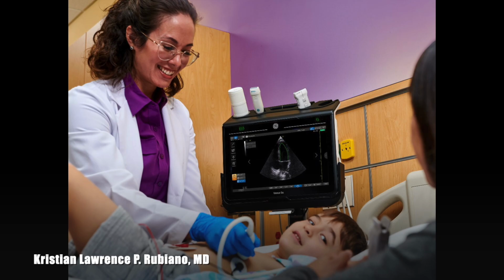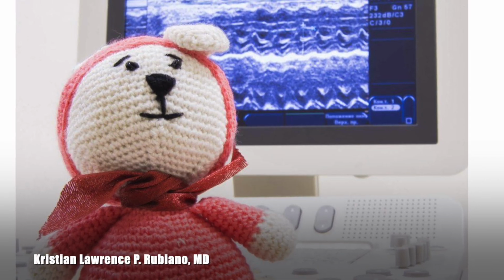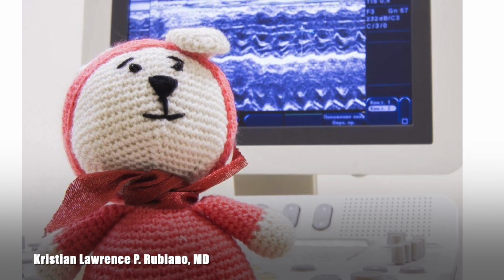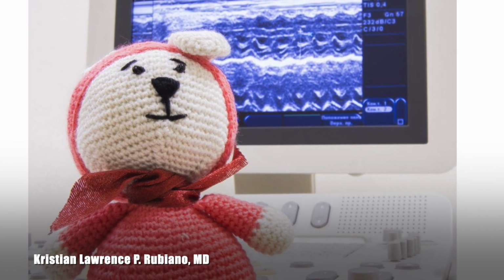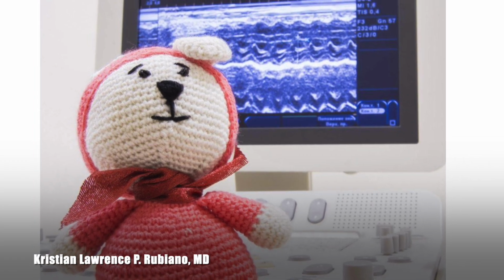Before doing the procedure, the echocardiographer must identify himself or herself to create rapport. We need to explain briefly the procedure to the parent or guardian and to the patient, especially in older children. As mentioned, we need to place the patient in a comfortable position. You may opt to use toys, musical instruments, or even gadgets to distract or calm down some patients. In some combative patients, we may give some form of sedation if all else fails.